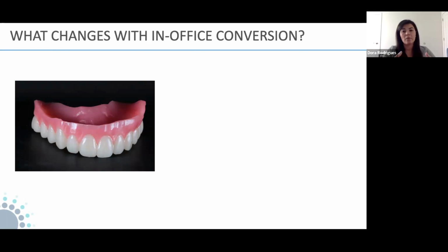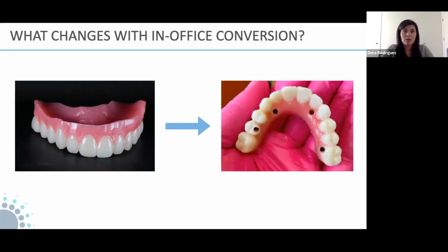It's just a different type of material. But if you want to do the traditional workflow, you can definitely just do that, because the only thing that changed was the denture material per se. But since 2019, there is a new system that I've been talking about in every single webinar or talk that I do about conversions. Now you don't have to make those big wide holes through the denture. You can just have that perfect screw access on your temporary right after your conversion.